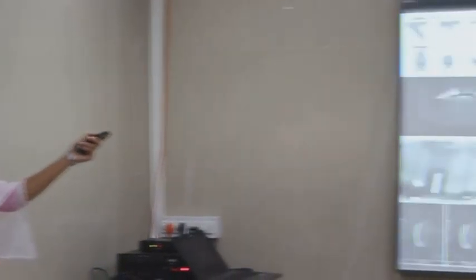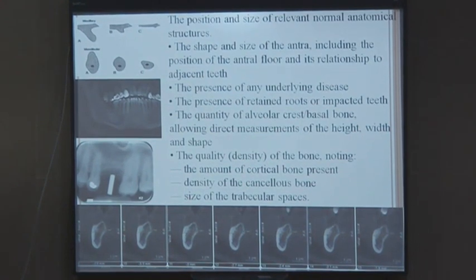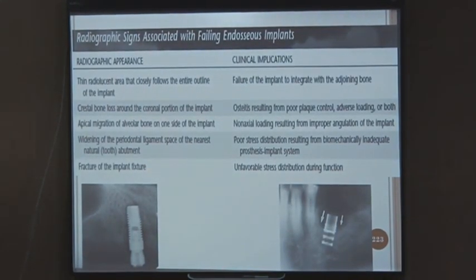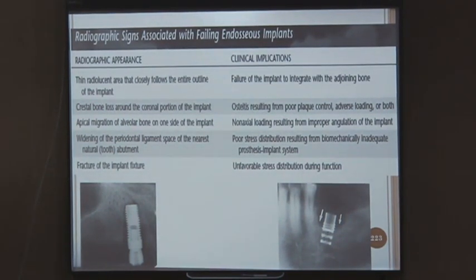So this is what I told you about CBCT. You are going to see the height, width, proximity to the adjacent structures and the nerve tracing part. So you do all this, you can place an implant. Apart from this, axial inclination of your implant. When one of this goes wrong, you will have this. This was one of your MCQ questions. Remember? Peri-implantitis was your MCQ question.